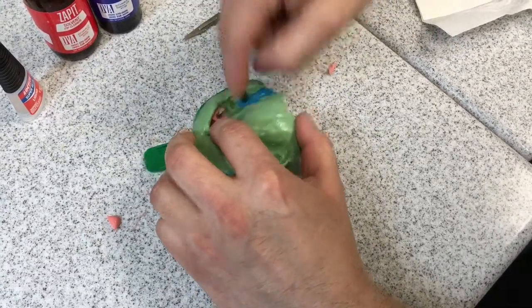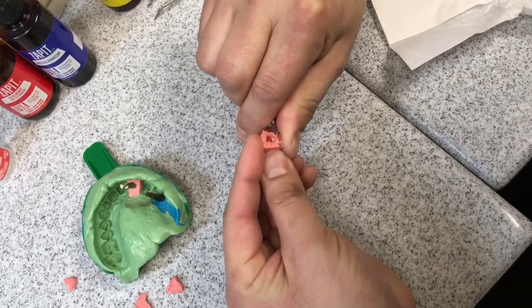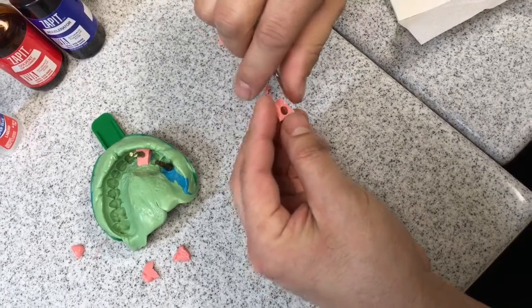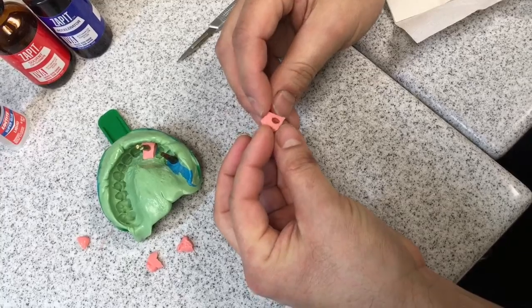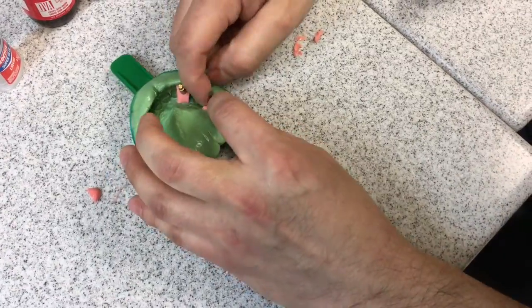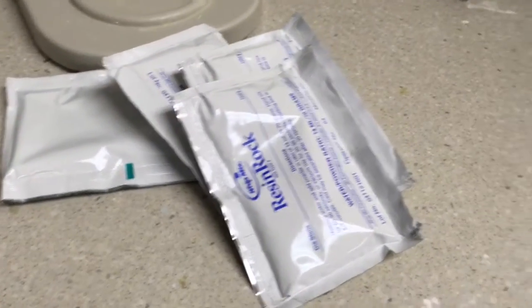Put this back in here, make sure it's seated all the way. Same thing with this one — make sure we're not cutting past that lip. That lip is still there, that's good. Go back into the impression — it should feel like a little pop when you put it back in. Get rid of all this excess and then we're gonna pour that up.